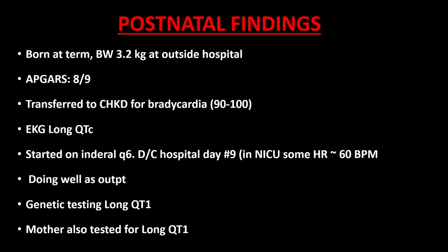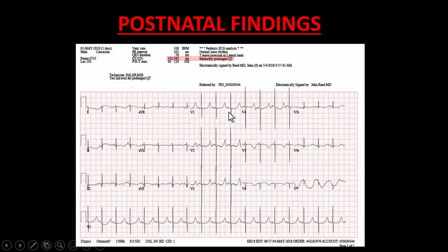On the electrocardiogram, long QT syndrome was confirmed, and the patient was placed on medication and the heart rate stabilized. Genetic testing was then performed, and this fetus and newborn was a carrier of the special mutation, making the diagnosis consistent with long QT type 1. Then the mom was tested and her father was tested, as a result of this suspicion on the fetus. And here is the postnatal electrocardiogram, where you can see that the QT was significantly prolonged.